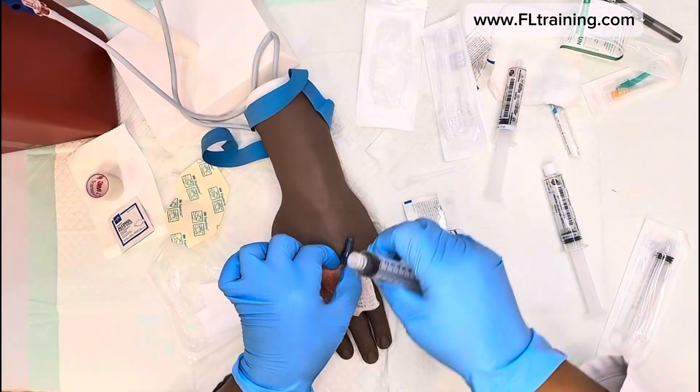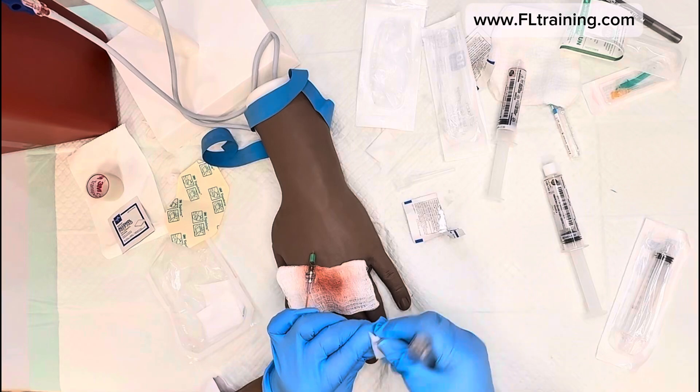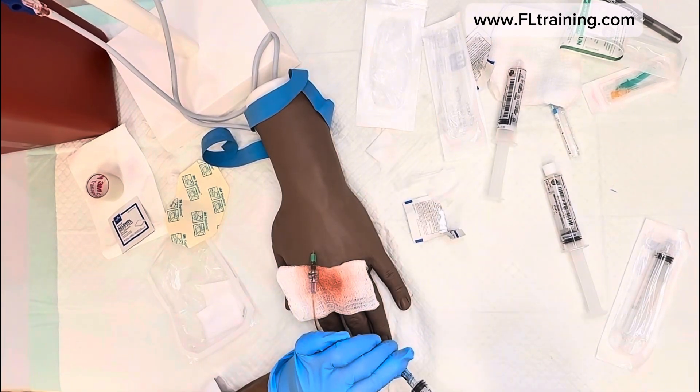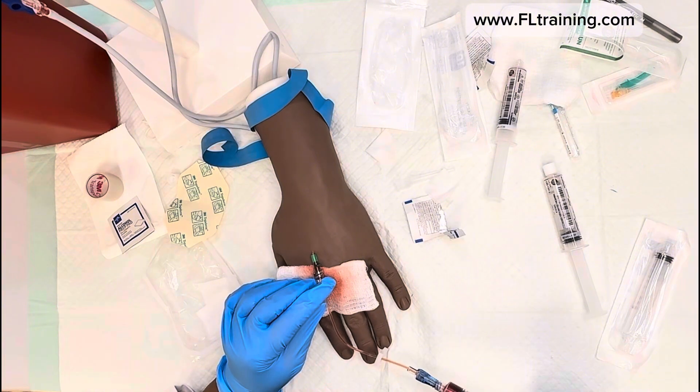I'm going to scrub that hub again, making sure I don't move that line too much. Now this is the specimen that I will use.